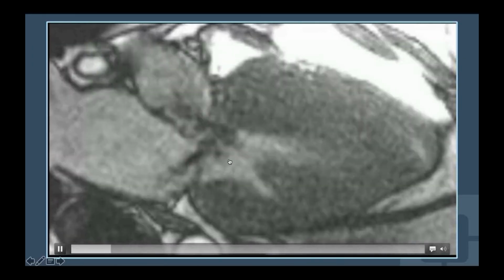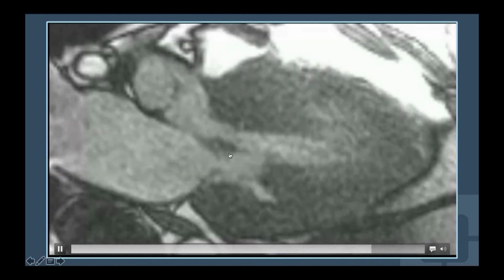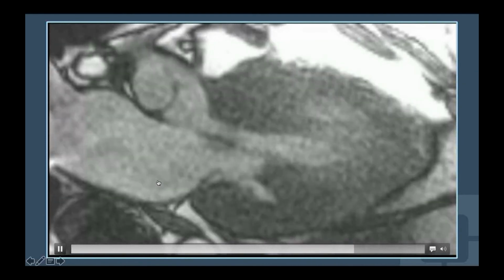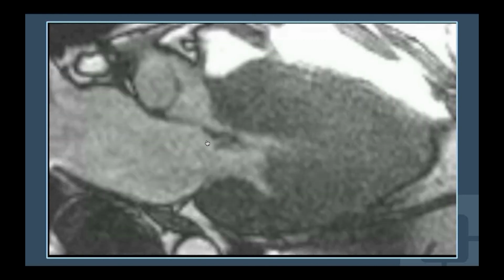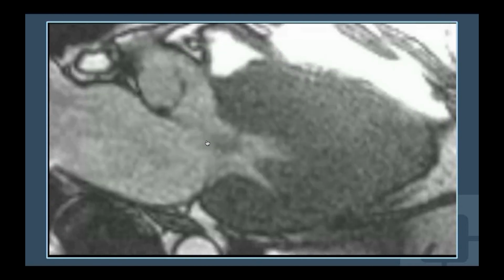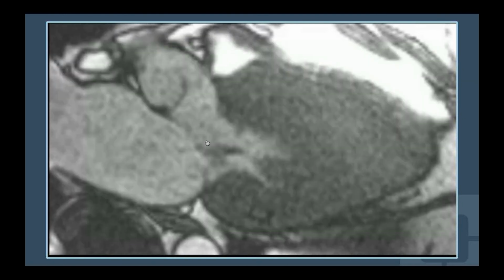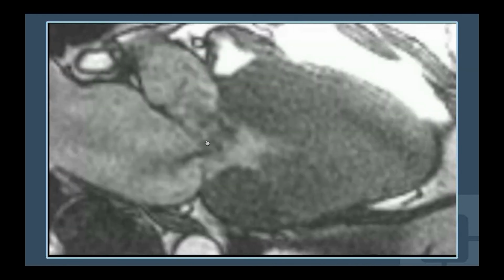You have the systolic anterior motion of the anterior mitral leaflet, and you can see it here during systole when it should be closing. It's actually moving due to that high velocity. It's getting pulled towards the septum, and that also causes the mitral leaflets not to come together as well, and so that's why you get this mitral insufficiency jet. Again, usually the jet goes in the opposite direction of the leaflet that's being affected. So this is the anterior mitral leaflet, so then the jet is posterior. It's directed posteriorly. That's a good rule of thumb when you want to try to guess where the abnormal leaflet is on any given case.